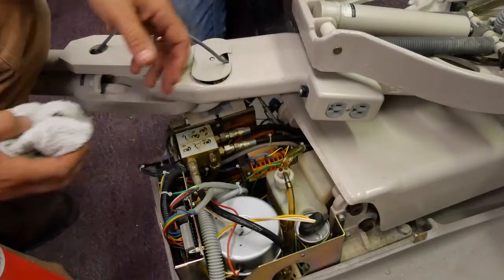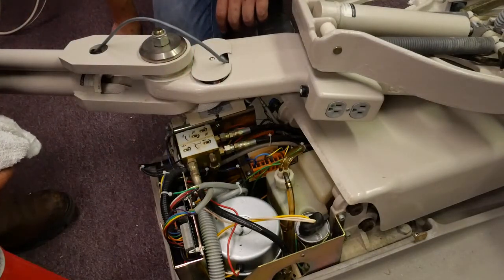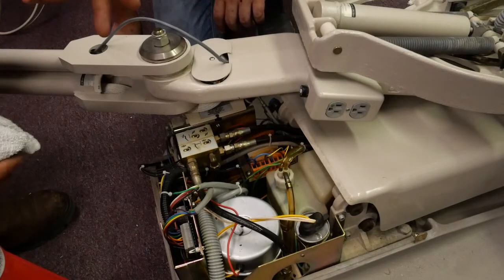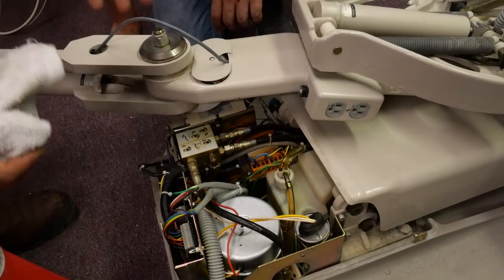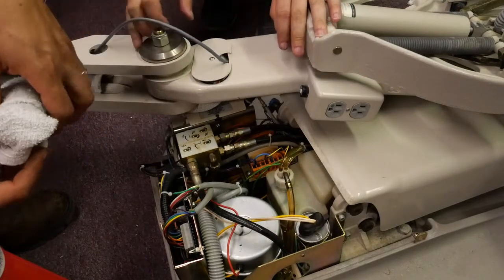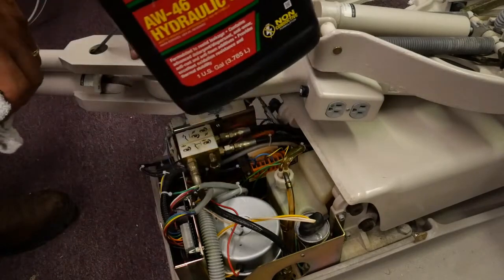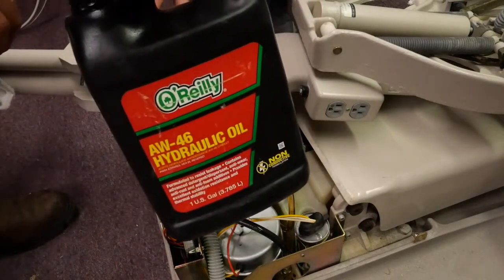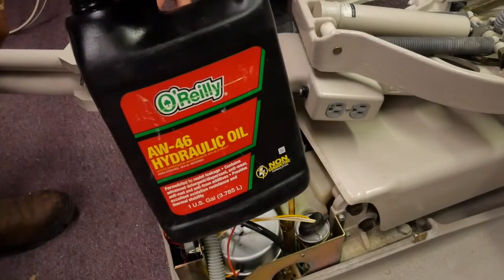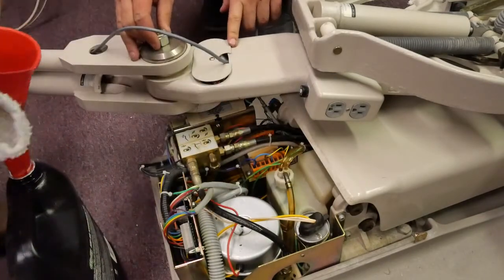So that is how we would adjust the oil level on a dental chair. Obviously, you saw me overfill it. That's how you would resolve that if that happens to you. You just pull it out with a syringe. And again, that is AW46 hydraulic fluid. All right. And I got that information from a reputable repair parts company.